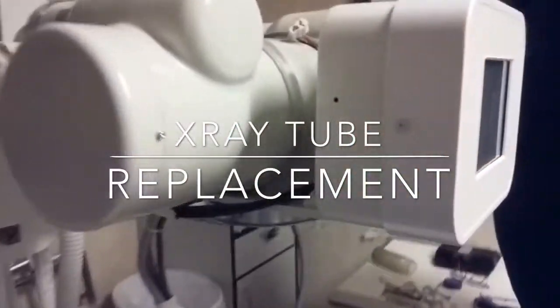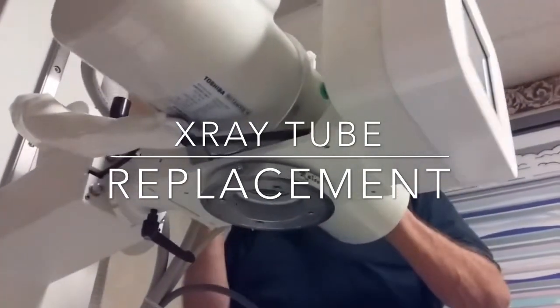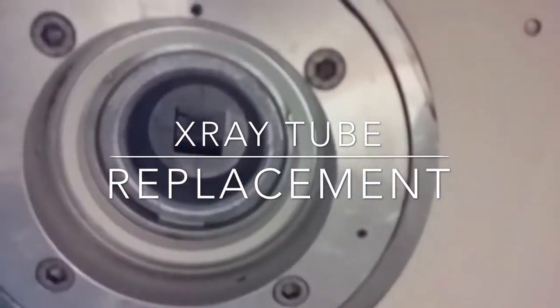We got the collimator off. And this is the inside of the x-ray tube.